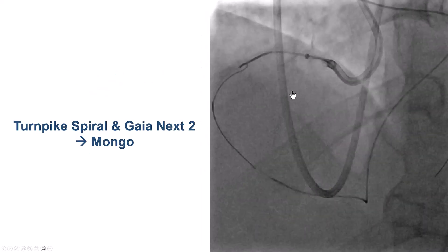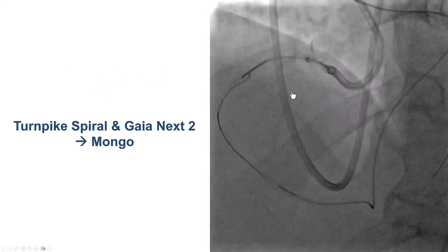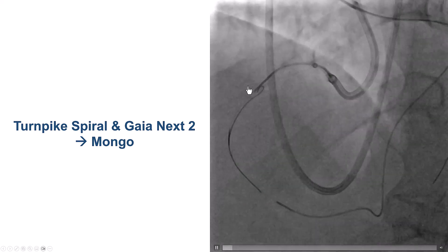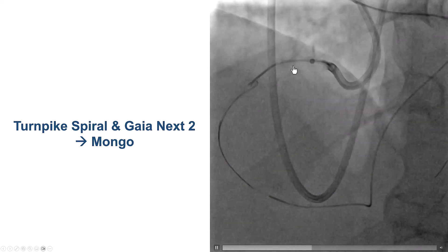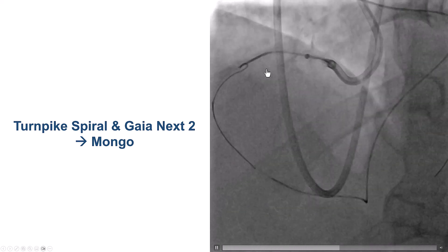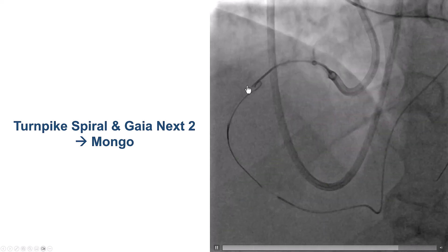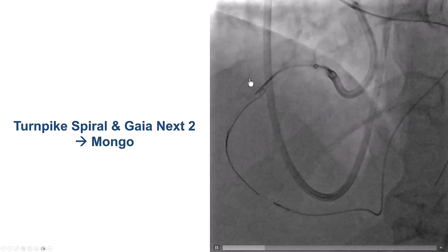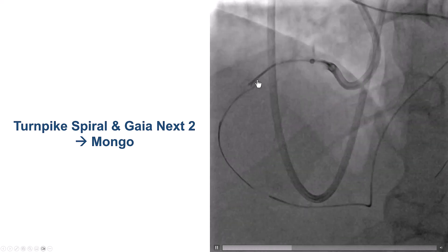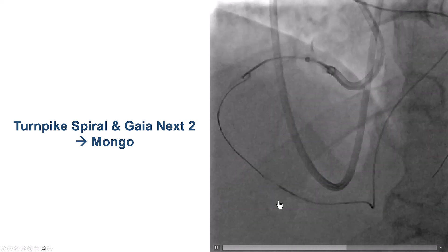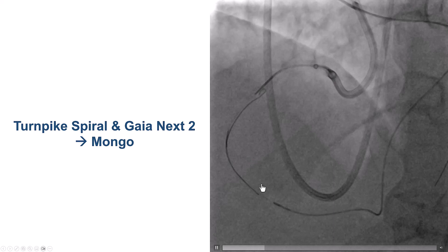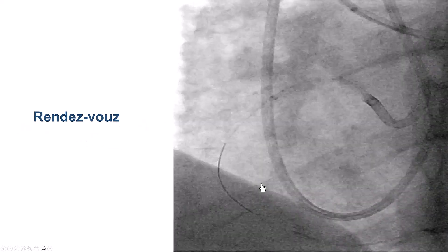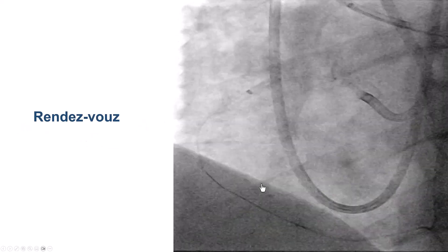We now had very good clarification of where the proximal cap was, defined by the retrograde wire. We then used an antegrade Turnpike Spiral with a Gaia Next guidewire. The wire seemed to advance along the course of the vessel distally — were we following the true lumen? A contralateral injection suggested we were on track.